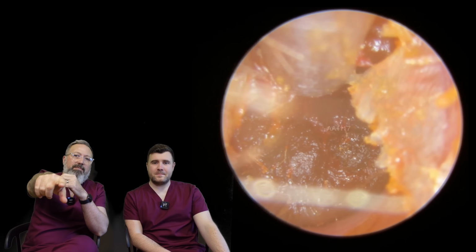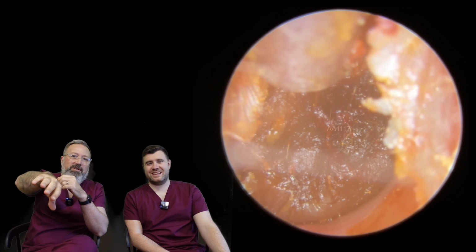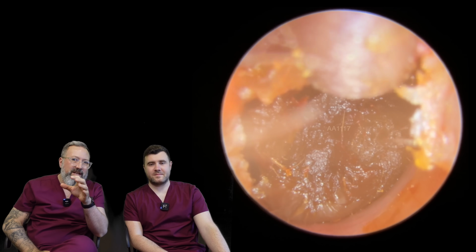So you can see I've got this flap of skin here, and we just try to shove it out of the way. You can see me moving across the left-hand side, just out of the way. So we get to this back section, but this is solidly stuck in here, this back section.